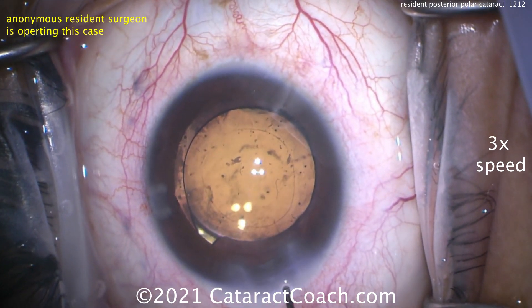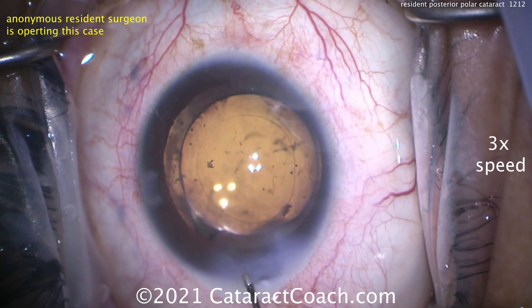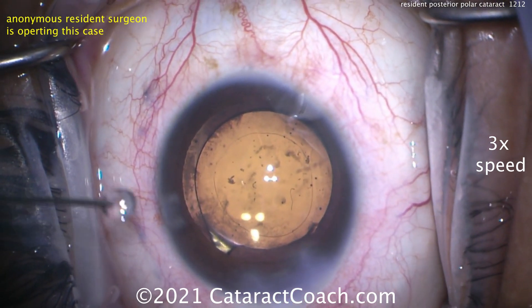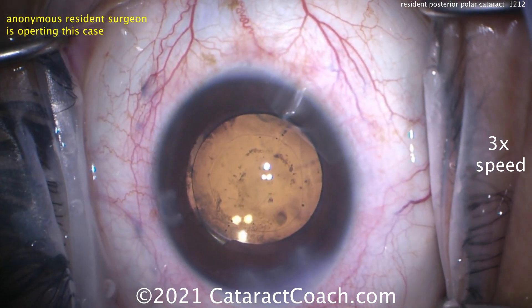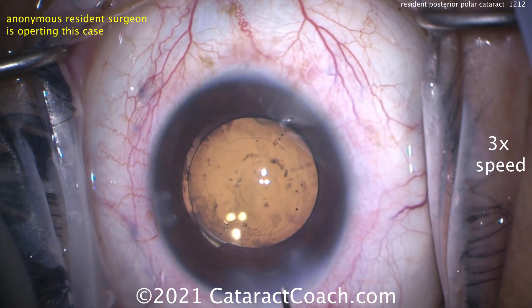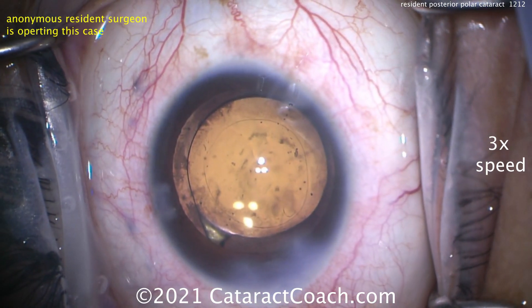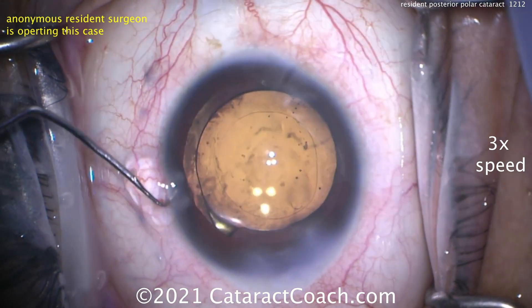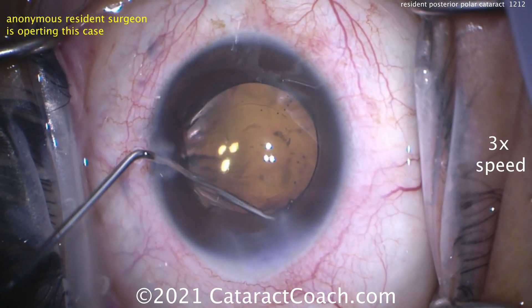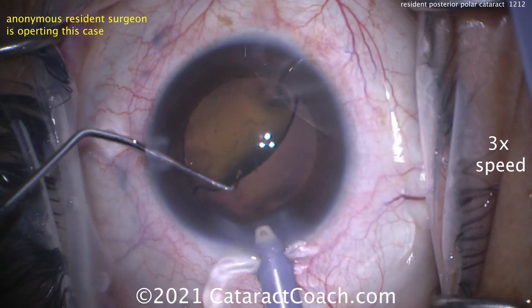Now look — I'll seal the incision first before removing viscoelastic. Why? I don't want fluctuations in pressure. I don't want that posterior capsule to be under any stress or to break. I don't want the AC to flatten. After the viscoelastic is removed from the eye, we get the lens rotated into the correct position. The eye needs to stay inflated, which means the incisions are sealed so the eye doesn't collapse. Now we're gently going to rotate it, and I'm going to lift the optic.